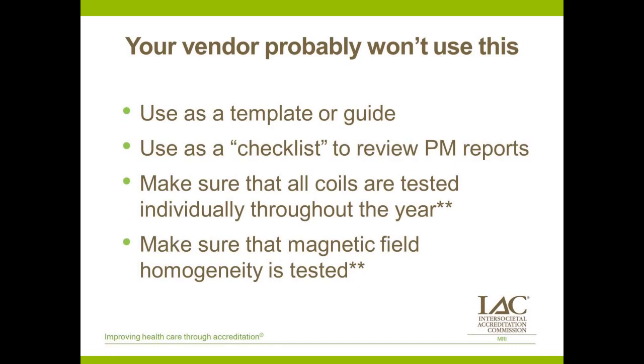So that's something that's important, and you want to make sure that that's listed out explicitly for each coil. The other part of that is if you're not getting numbers back, you'll want to ask. And some companies may say, yes, we can produce a supplemental report that will give you that information.